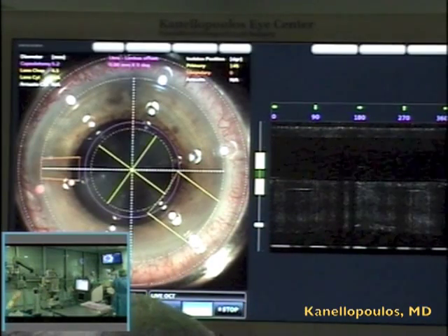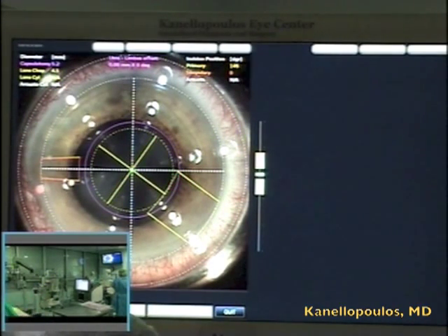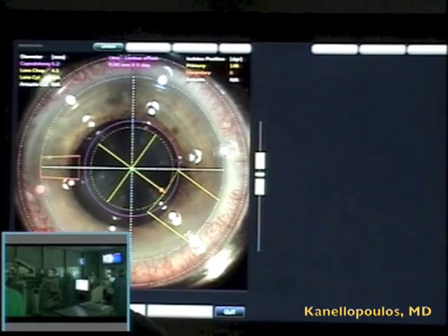Fascinating developments in cataract surgery. We've been working with the LensX femtosecond laser for the last year. You're seeing here a patient applanated with a new soft fit version of the LensX, which entails a special contact lens between the patient interface and the patient's cornea.